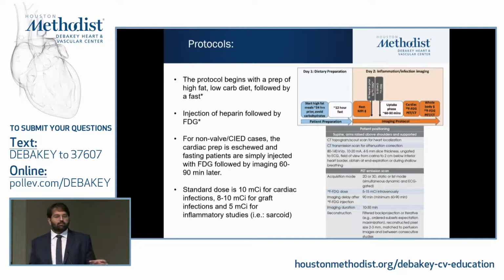This prep is only for prosthetic valve cases or ICD cases where you want to make sure that the heart is suppressed so that you can see the valves clearly, or you can see the pacemaker lead, which is adjacent to the myocardial wall clearly.